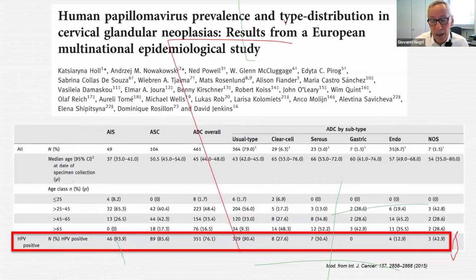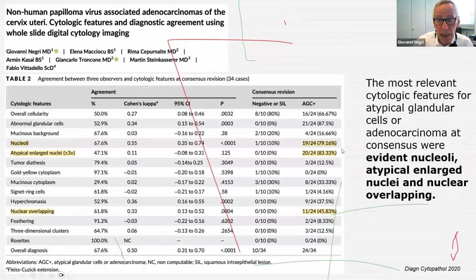So the issue is that these cancers, in the old terminology, were also called adenoma malignum. They are mucinous cancers, and they often show a very high differentiation. So they may be difficult to recognize even in small biopsy specimens. In cytology, in our experience, it's usually not so difficult because you have a higher number of cells and not only a small biopsy specimen. And somewhere you are going to find clearly atypical nuclei and particularly nucleoli.